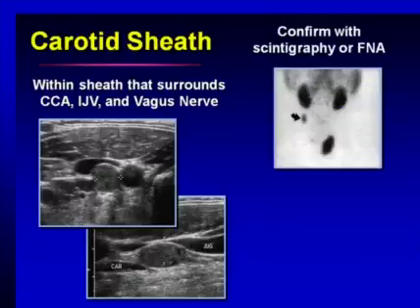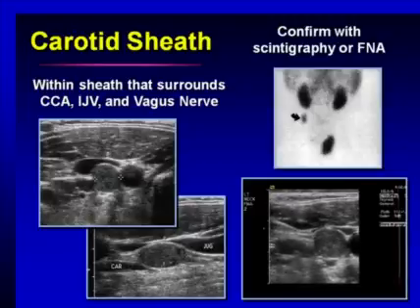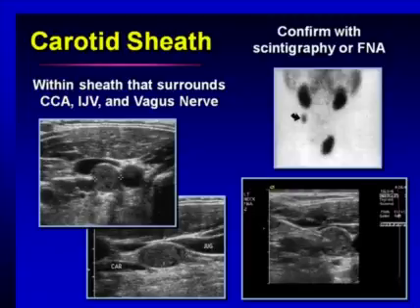This patient also had a nuclear medicine scan that showed this activity in this place laterally in the neck, and the patient had had previous operations in an attempt to identify this, so certainly wanted even more information before having an additional operation. So with confirmation, fine needle aspiration was performed where a needle was inserted into the nodule, avoiding the vessels and obtaining material.